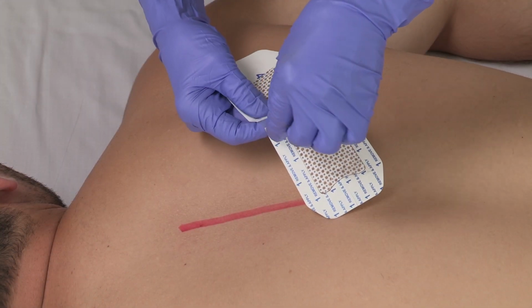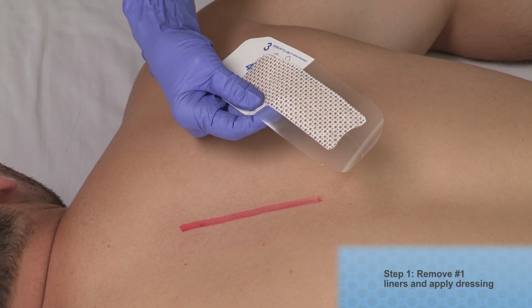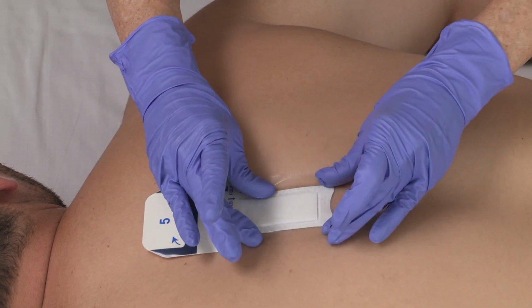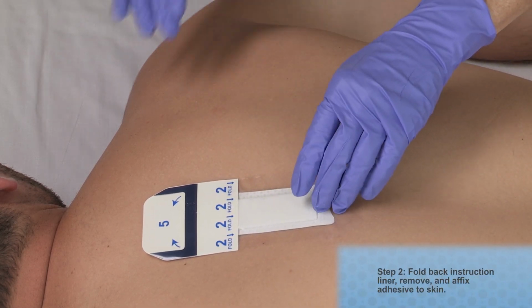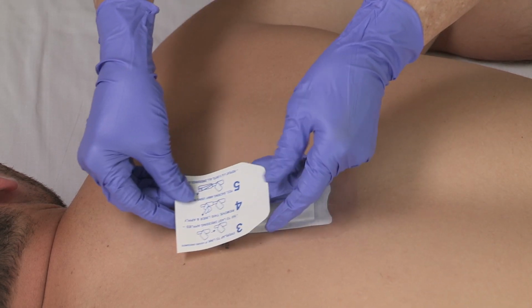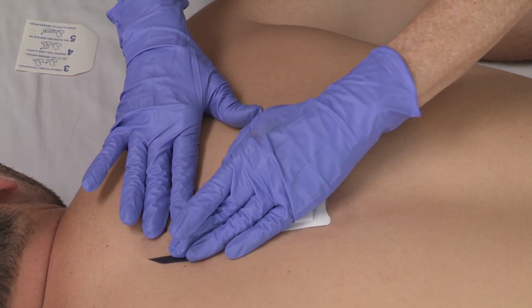Following the instructions printed on the product liners, remove the number 1 liners and apply the dressing. Press gently to ensure direct contact of Procellera pad with the wound bed. Next, fold back the instruction liner. If you're only applying one dressing, remove the instruction liner and affix remaining dressing to the skin. Gently press and rub adhesive to firmly adhere.